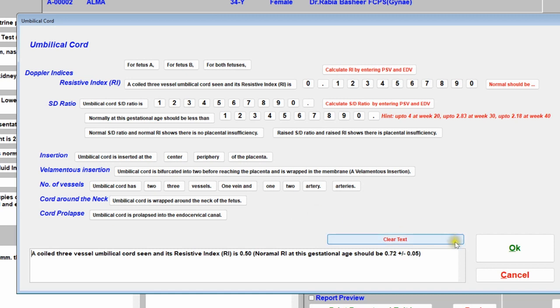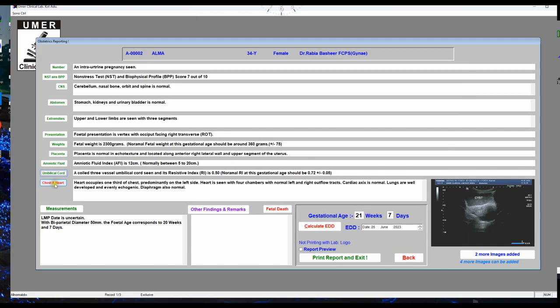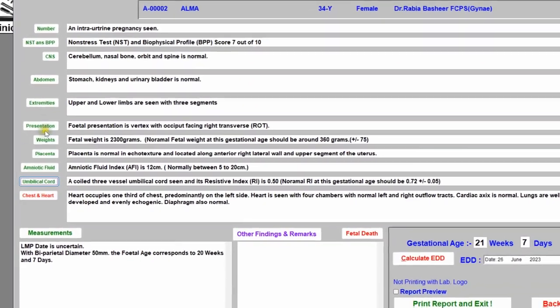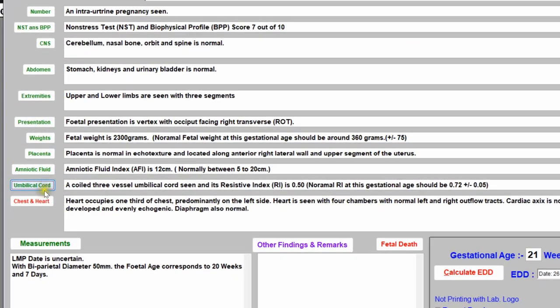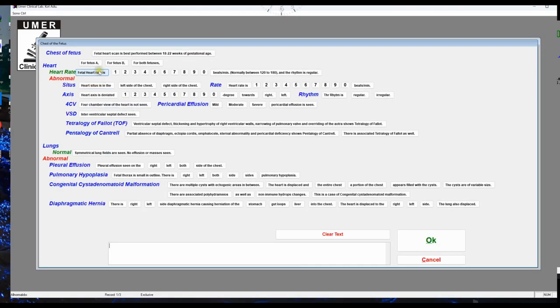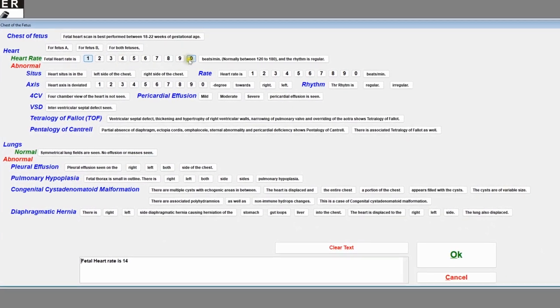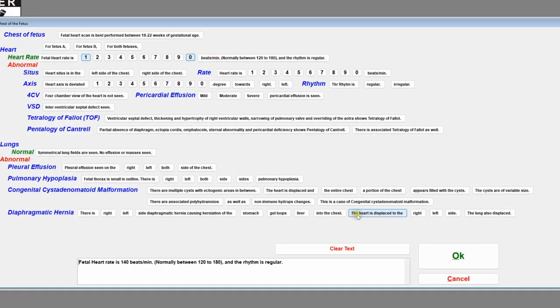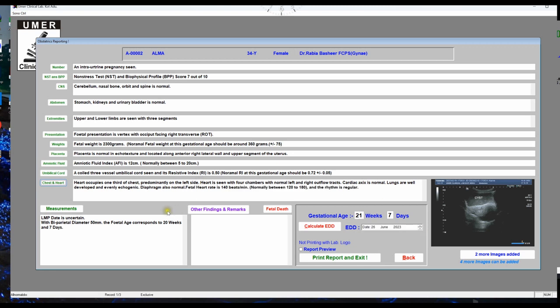You will notice that before clicking the buttons they appear red, and once you have properly edited each field it turns green, confirming completion. Click 'Chest' — suppose the fetal heart rate is 140 beats per minute — click OK and everything will be written on the report screen.